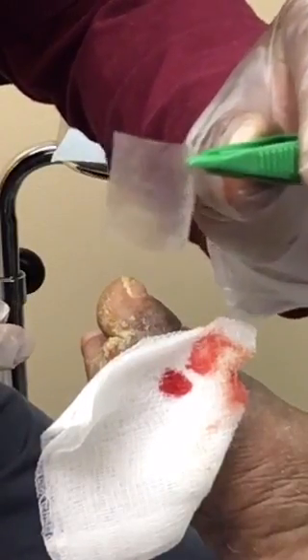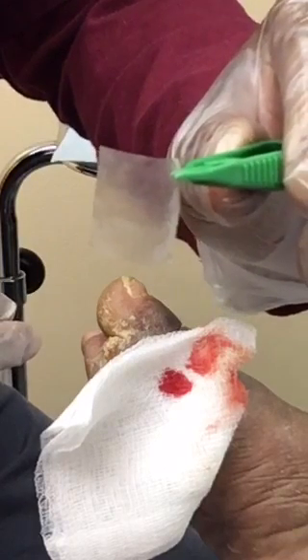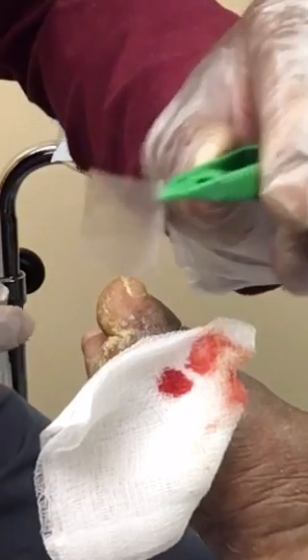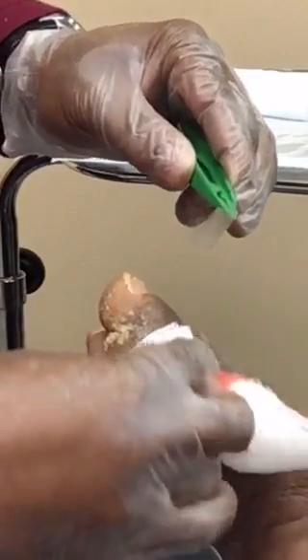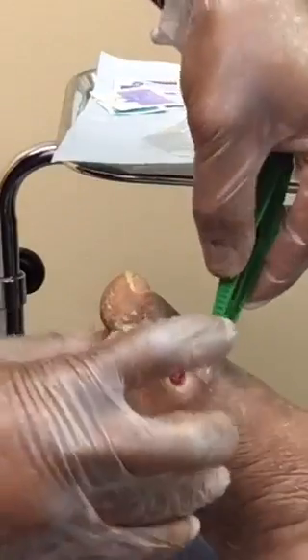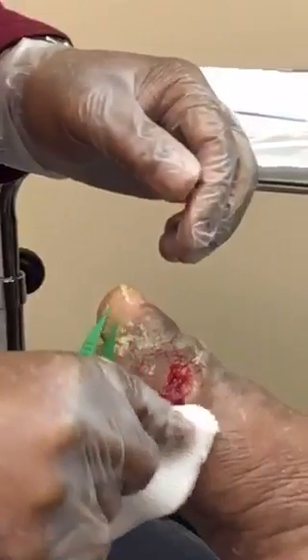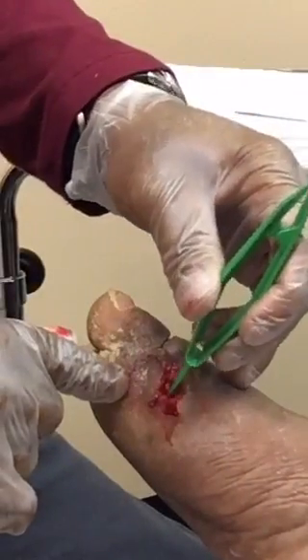This is processed human amniotic tissue. It contains growth factors and different types of collagen to help improve and speed up the healing process of this wound. Having a little blood is good because it helps the graft to stick. So I'll just put it right on the wound — there we go. That's it. That's the process in a nutshell. The graft now has good adherence to the wound bed.